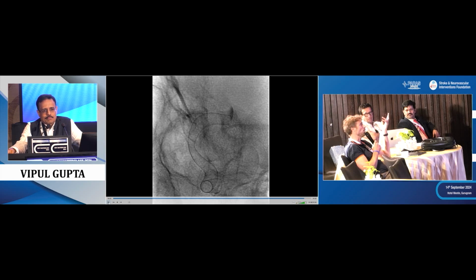You will go very distal, making a stent, making a thrombectomy. There is chance that it is working because it's just very recent. So it's a red clot. But you are still adding something more to the procedure. You will have to pass through your flow diverter. I would probably just do pharmacologic, like you did, depending on the complexity. If it's really straightforward, it's a proximal M2, I will make a pass as well. If it's very distal, I will maybe look at the angiogram, see if there is collaterality, as we said this morning in secondary review, assess collaterality, assess functionality, and make your decision.